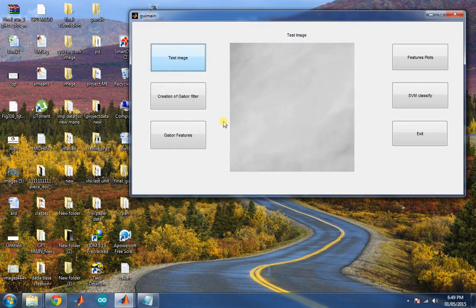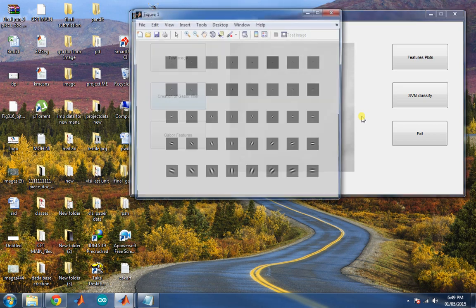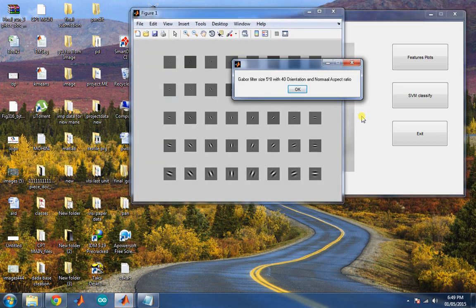Then create a Gabor filter for the given application or test image. So Gabor filter is designed with 5 by 8 with 40 orientations.